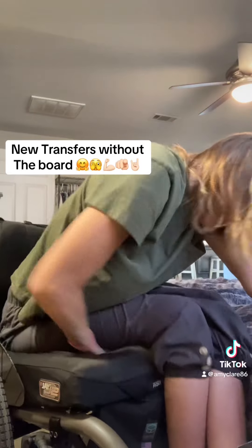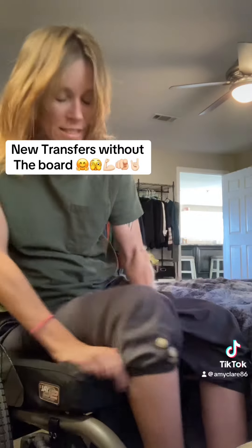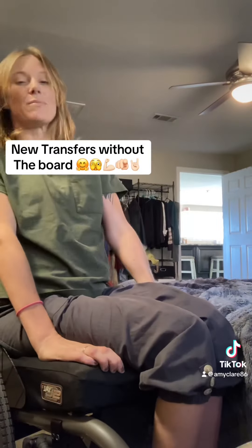Lift like this — I just throw my butt over. Especially if I don't want the chair to move, I kind of try to keep my hands closer to my thighs.